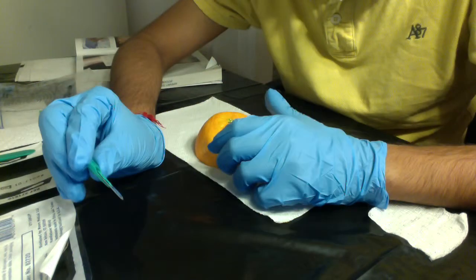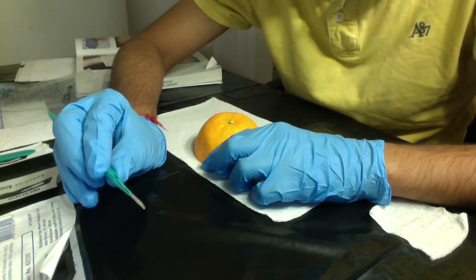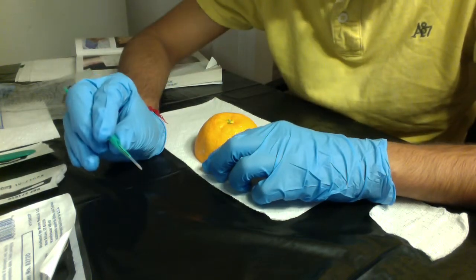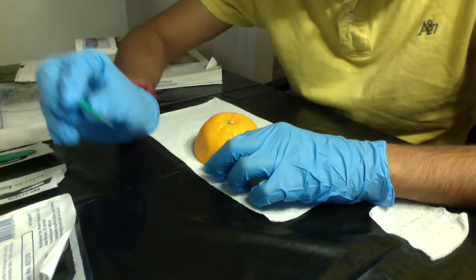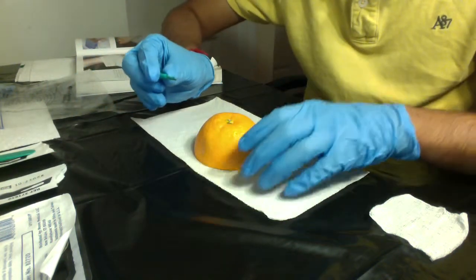I'll be using the blade to do a shaving and paring process. Now initially the blade is kept at an angle position, and then gradually, to cut the wound, it just slides down close to horizontal. So I'll be demonstrating this.